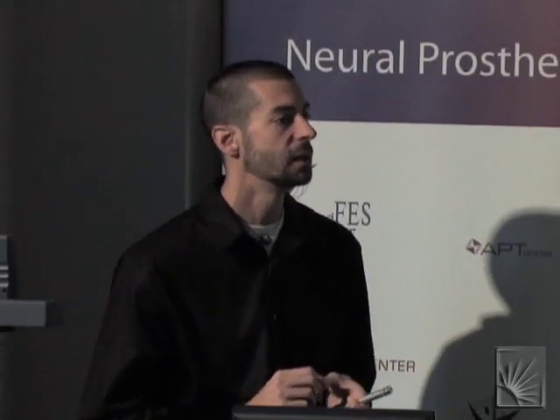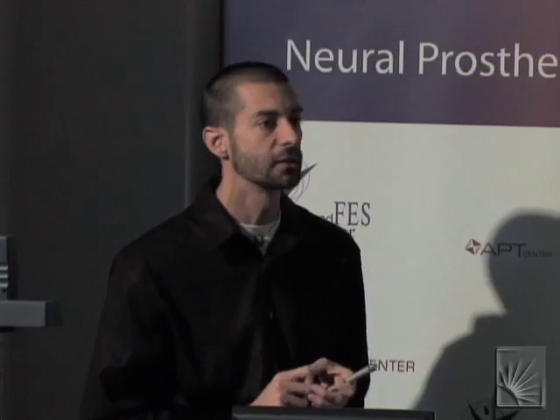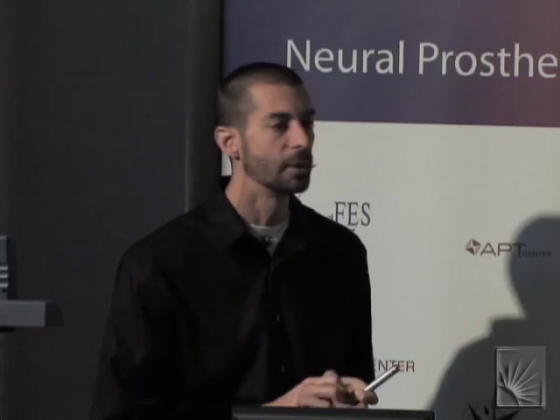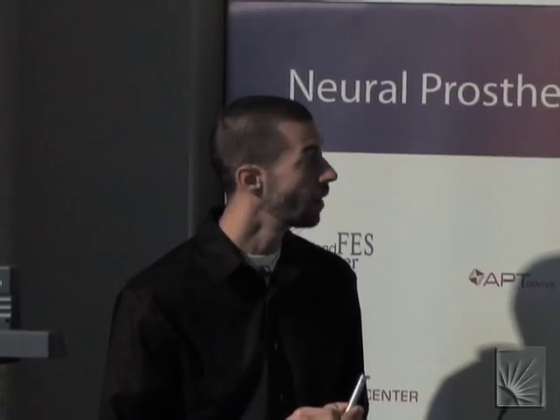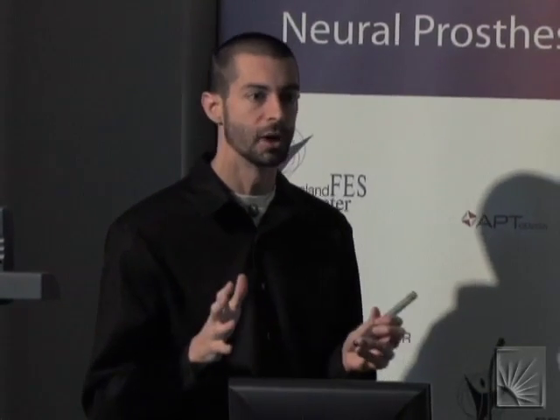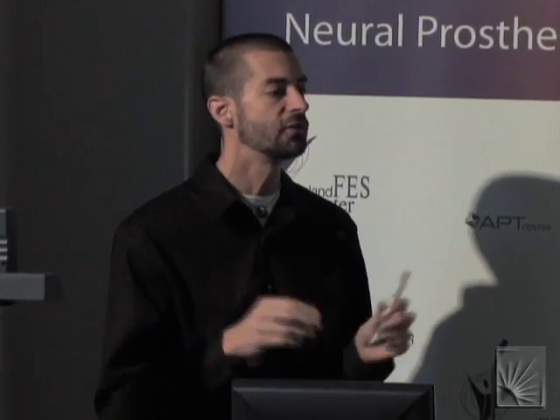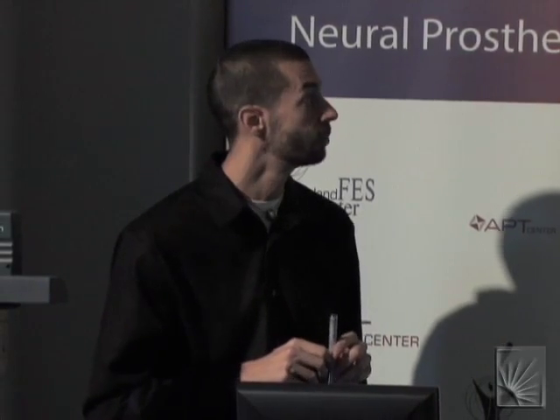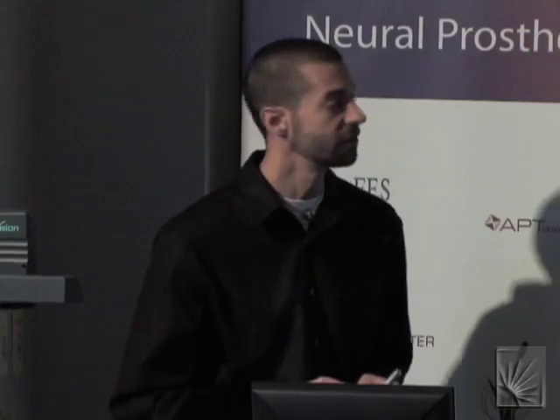The point is that using just very simple techniques to modify these brain atlases and put them into a common coordinate system doesn't look very promising. Well, the reason is that every person's brain is different, and in fact, until I started working on this, I had no appreciation for how dramatically different the geometry of different patients' brains really are. So how can you account for this stuff?